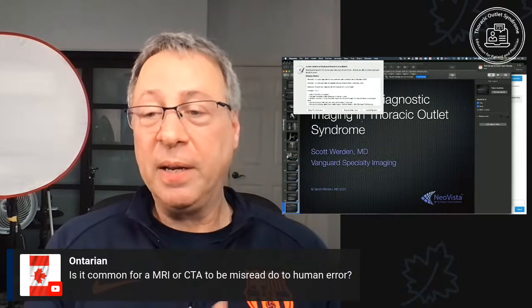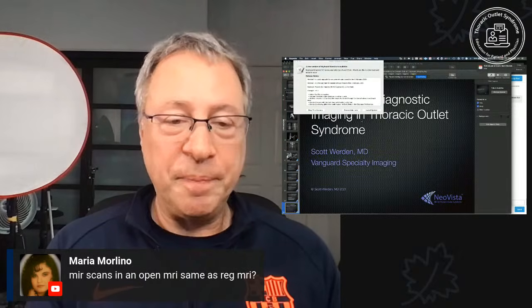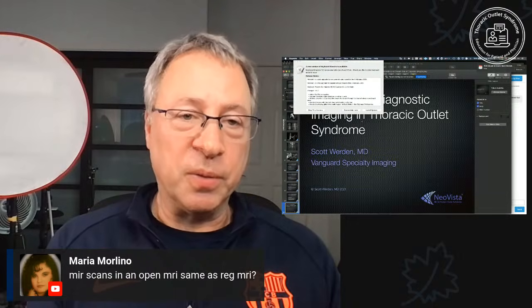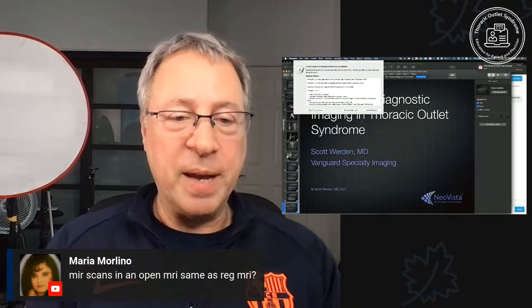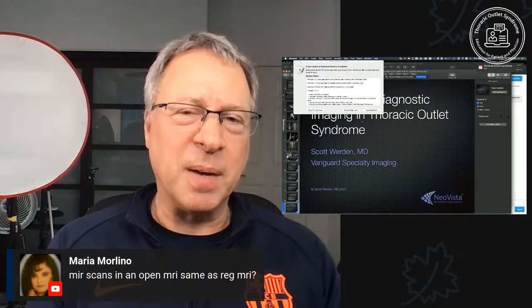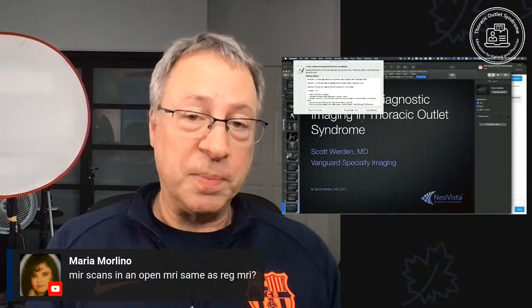Is open MRI the same as regular MRI? Thank you for the question, Maria. An open MRI is meant for patients who don't feel comfortable in the tube of the MRI scanner. I've had MRIs myself, and sometimes I've been comfortable and sometimes I've been a little bit edgy about it. So the open MRI feels better.